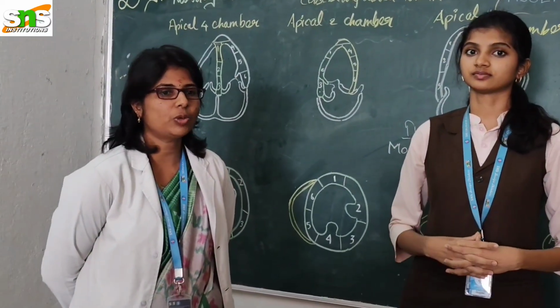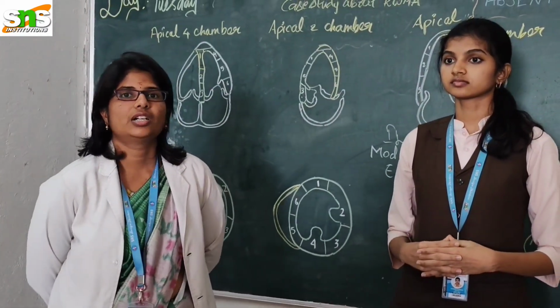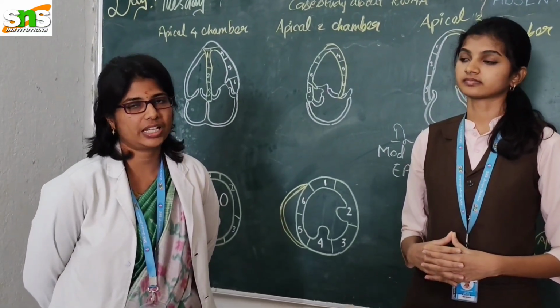So mild to moderate LV systolic dysfunction, and the EF is about 40%, which also leads to a future risk of heart failure due to elevated chamber pressures in the left heart.